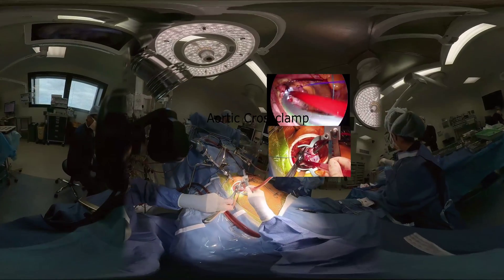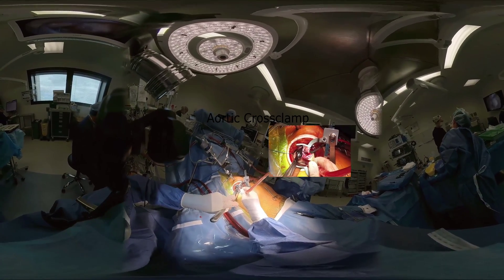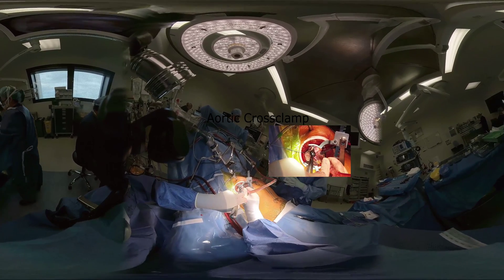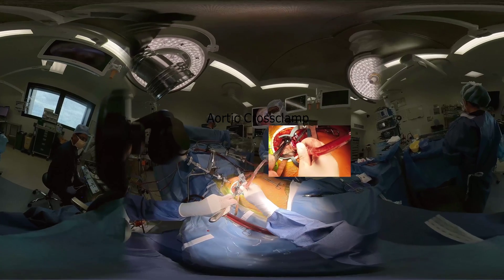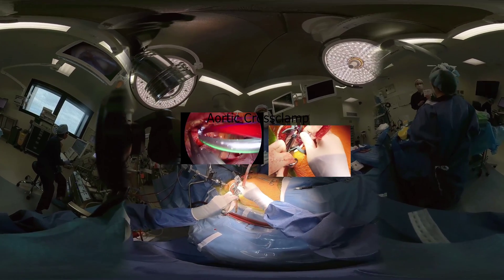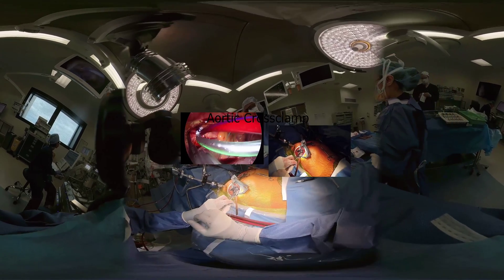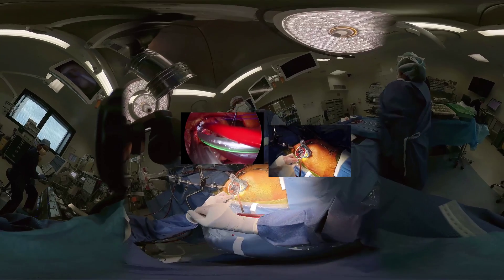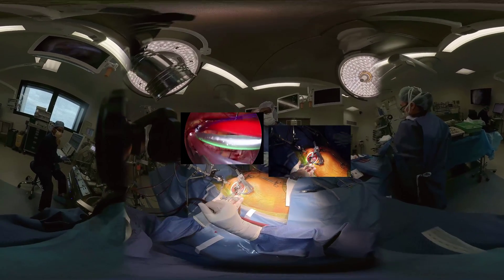Once this line is primed, a detachable aortic clamp is placed into the ascending aorta — we use the Glauber clamp. A dose of antegrade cardioplegia is delivered into the aortic root. Cardioplegia and cardiopulmonary bypass settings can be tailored to the institution's preference.